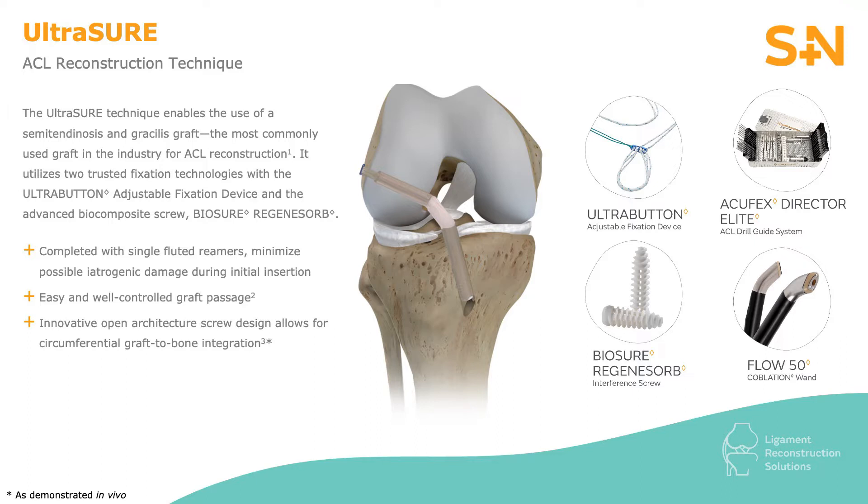The ultra button makes it far easier for the surgeon as it eliminates any preoperative and intraoperative calculations that were previously involved using the endo button. The adjustable loop seats the graft with no thinking involved. On the tibial side, my preference is to use the Biosure Regenosorb interference screw, sized line to line with the tibial tunnel diameter.